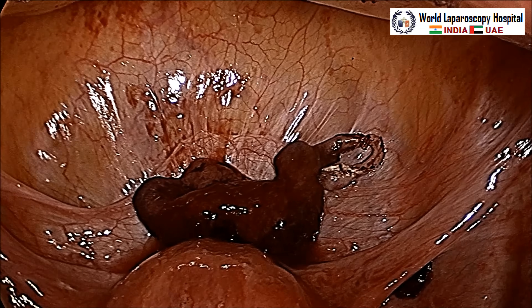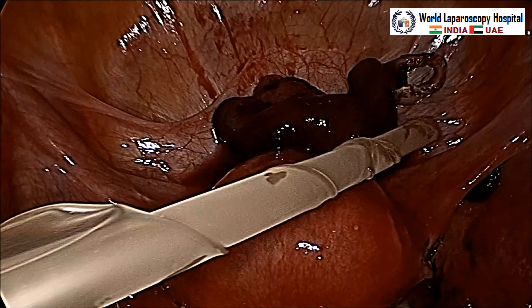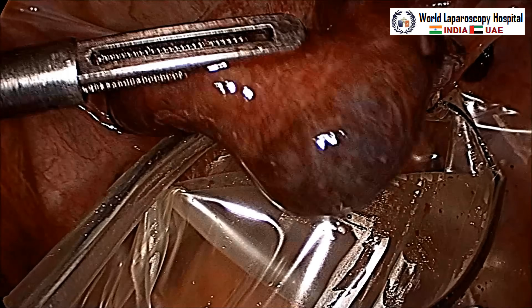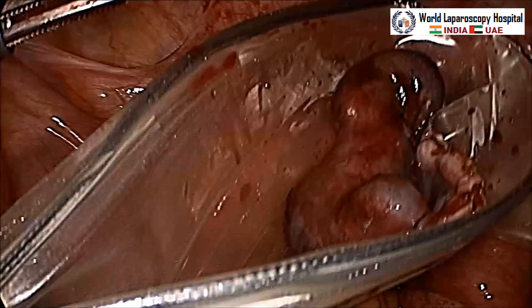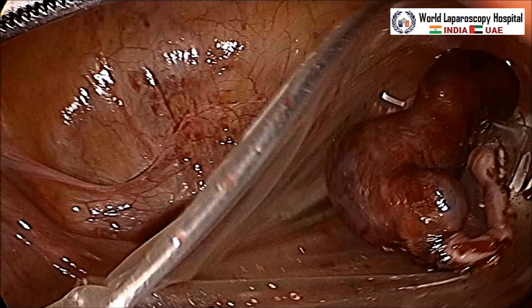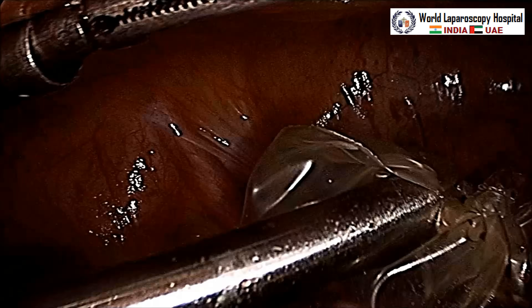After coagulating six millimeters from the uterus to seal it nicely, the tube is cut. Now take an endobag — this is a commercially available endobag with a self-retaining metal ring so no grasper is needed to hold it. It has a wide mouth and can accommodate up to bladder size. The entire trophoblast together with the tube is placed into the endobag. Close the mouth using the purse-string mechanism and take it out. In ruptured ectopic pregnancy, endobags prevent rupture during removal. Alternatively, gloves, condoms, or DIY endobags can be used.